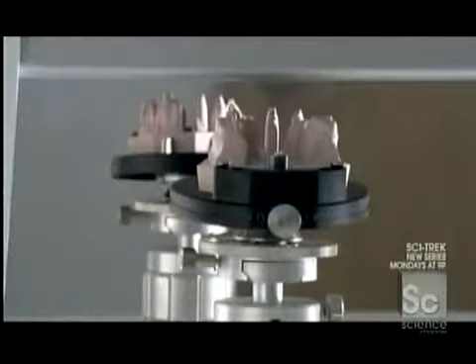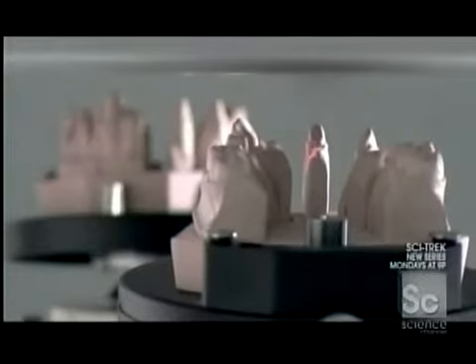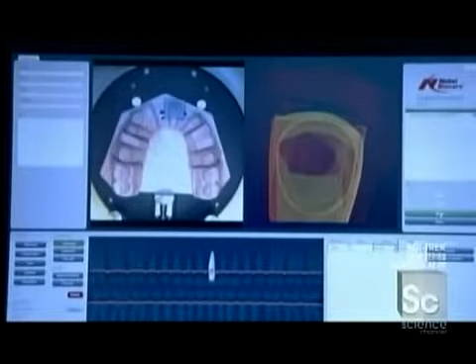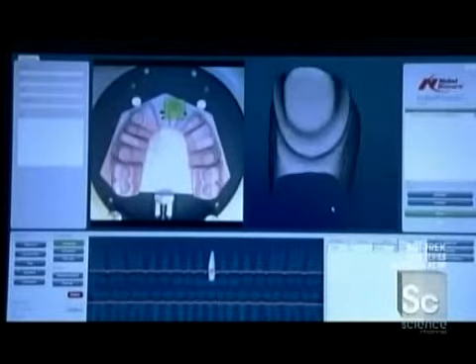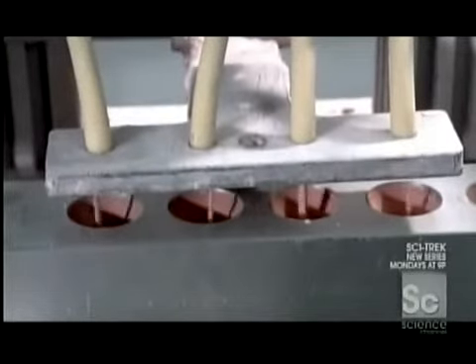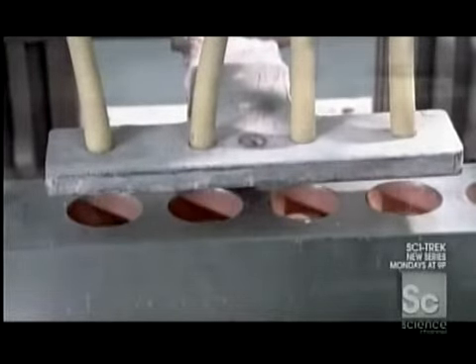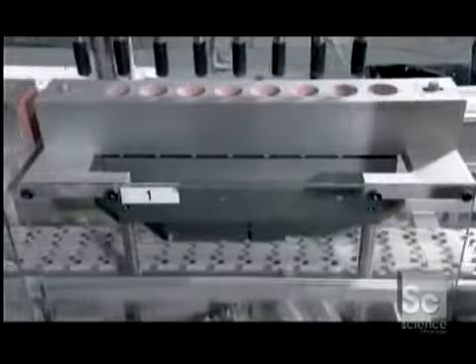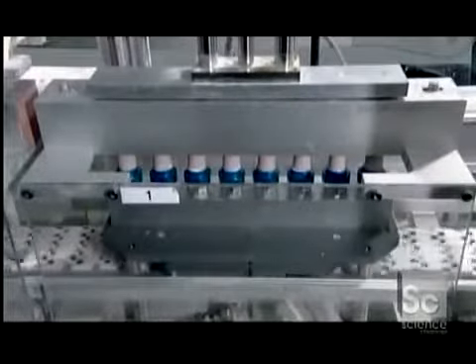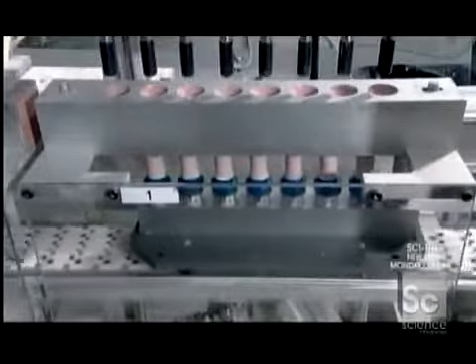It goes to a laboratory where they cut it into segments to isolate the tooth in need of restoration. They scan it into a computer and send the dimensions electronically to the factory. There, machinery pumps liquid plaster into molds to create cylinders called blanks. The plaster blanks take about 10 minutes to harden, then move on to cure for an additional 12 hours.